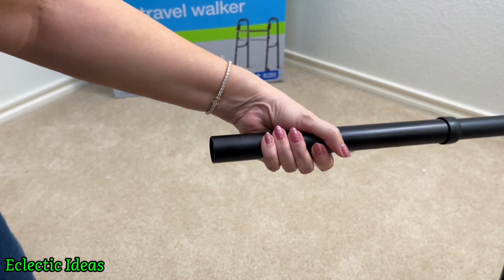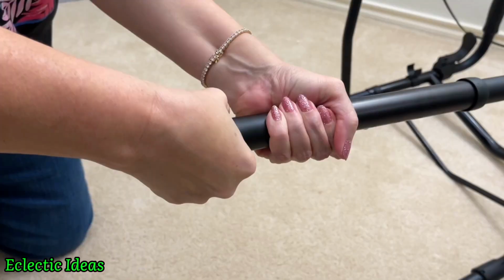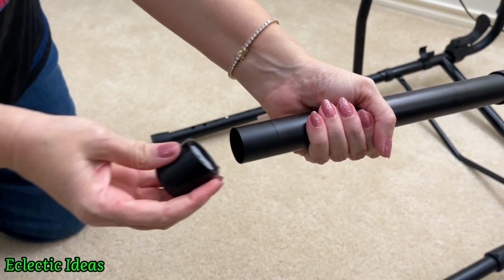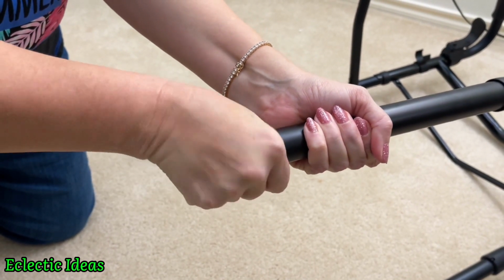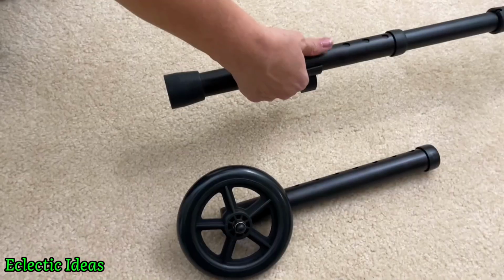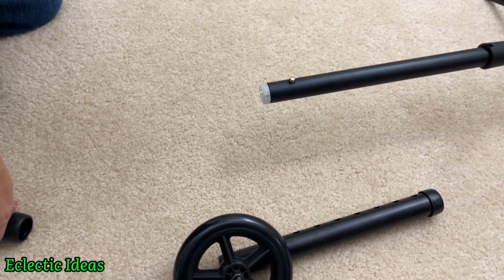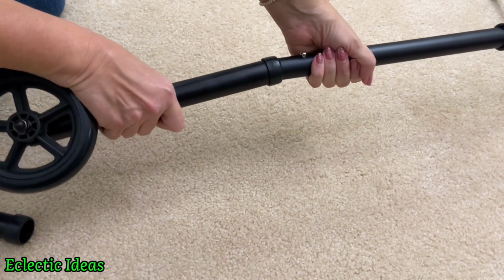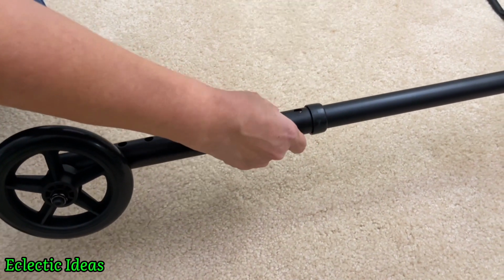We're pulling off the foot caps and we're putting on the glides so that when we install our wheels, it'll roll more smoothly. Pull it off really, really firmly and then put these glides on. And it takes a little, there you go. And pull the legs off and we'll put these wheels on. It just slides on like this, and we're going to depress that silver notch and just notch it down.